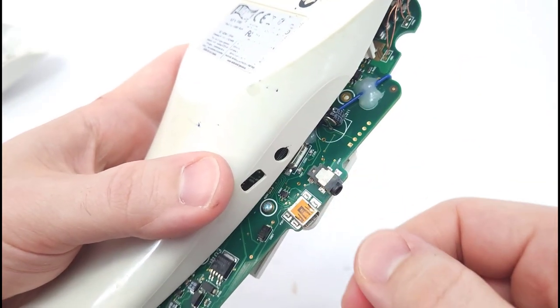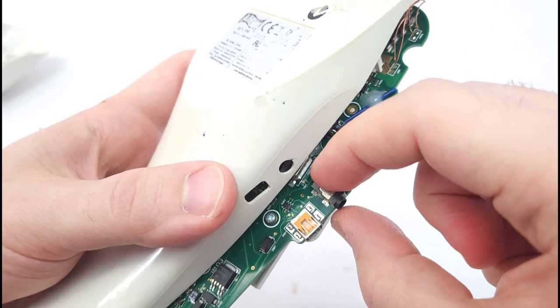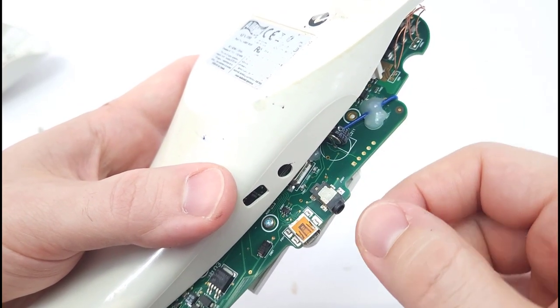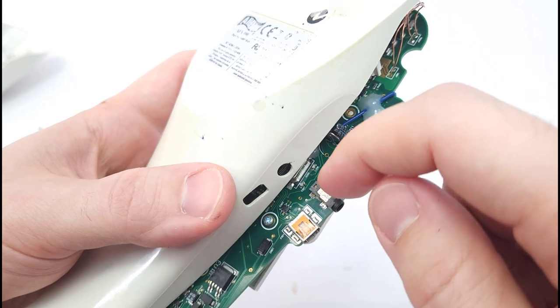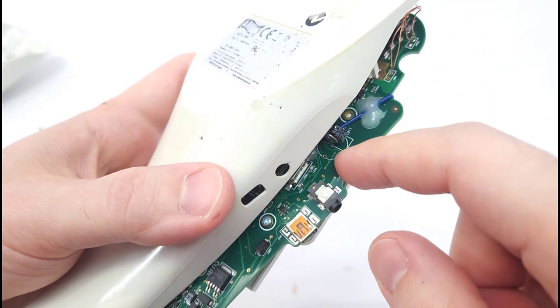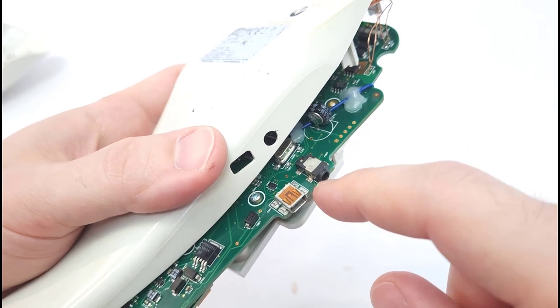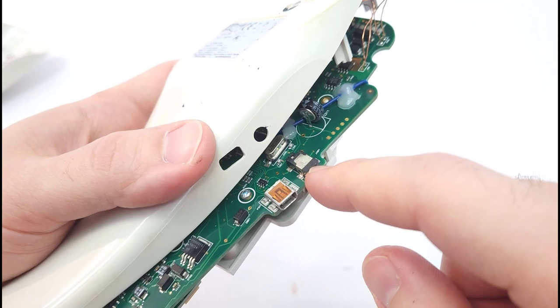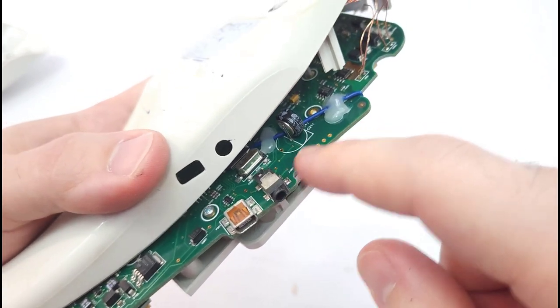Mechanically, over years of plugging in and removing the charging cable, this actually came loose, so the charger was fine and the rest of the board was fine, but the contacts between the charger and the board were no good, so it wasn't actually receiving power and charging. For the last one I did, I also had to redo the connections and re-solder this jack on there, and then that fixed that.